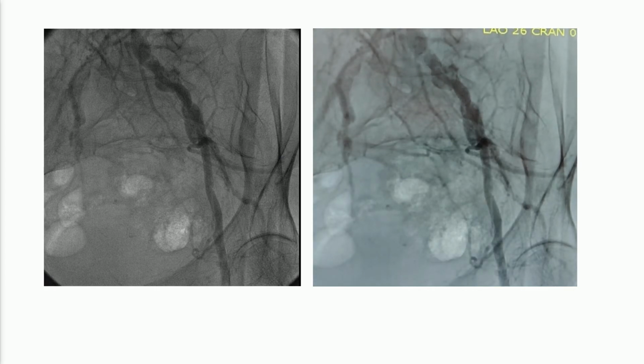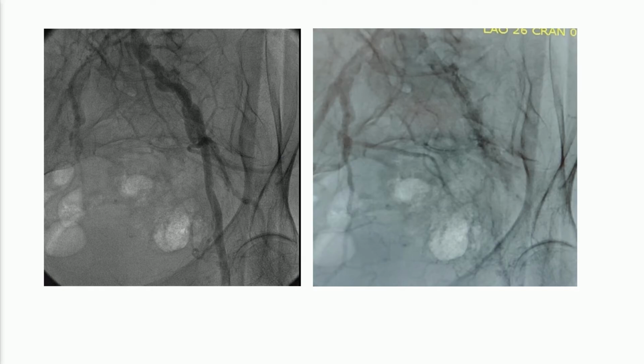Okay. This is a huge calcification of the iliac with a tight stenosis in the ostium of the iliac near the aorta, and a very big calcification in the aorta also.